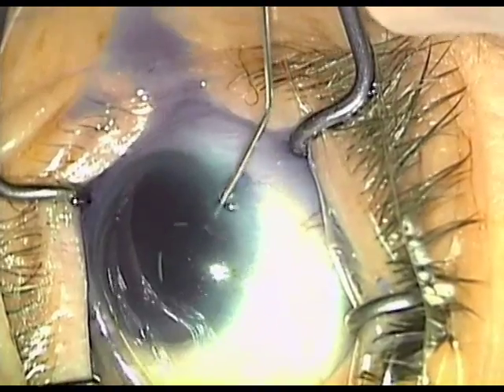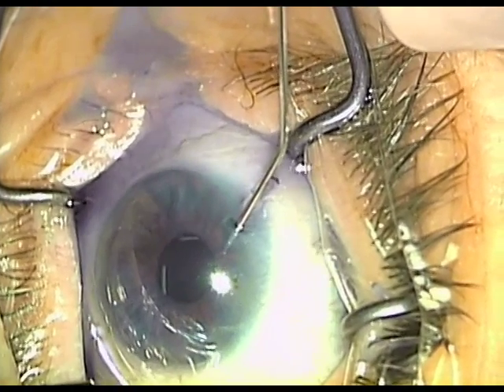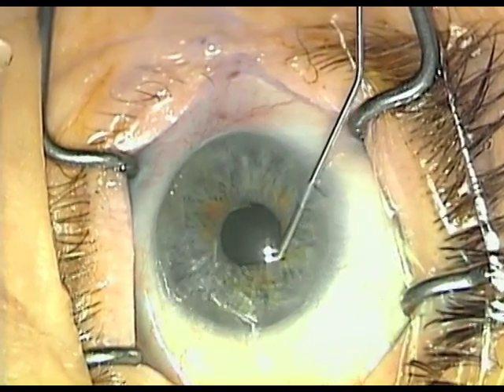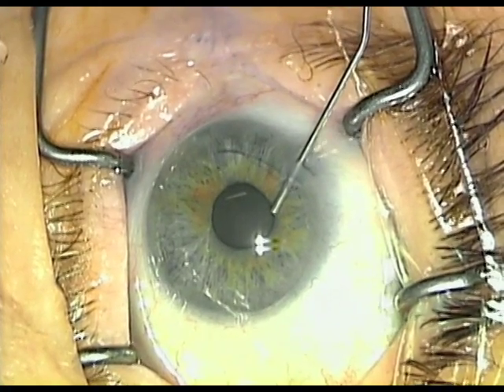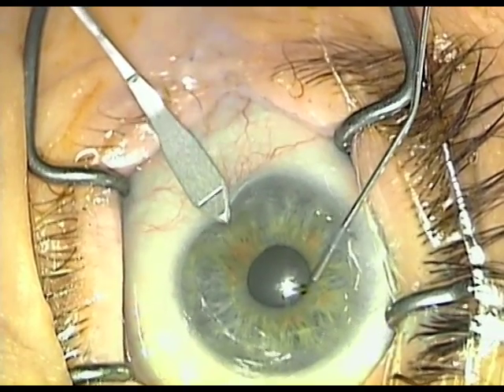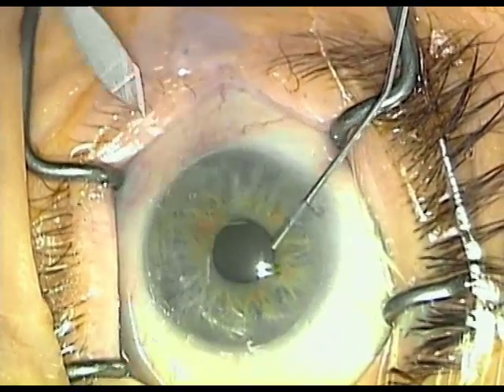Hello, this is Dr. Sean Cohen and today I'll be demonstrating the Small Pupil Phacoemulsification Technique. This technique utilizes Vision Blue to stain the capsule and make it more fragile so that we can open it, and also increases our visibility as we remove it. We'll use a 2.2 millimeter opening with an undulating up-and-down approach to create a better seal.